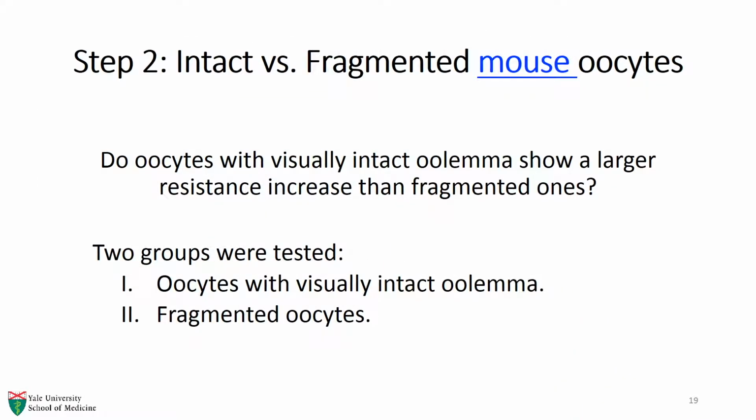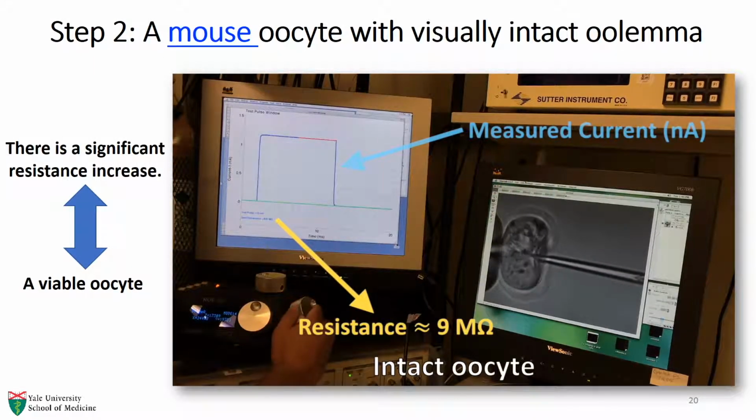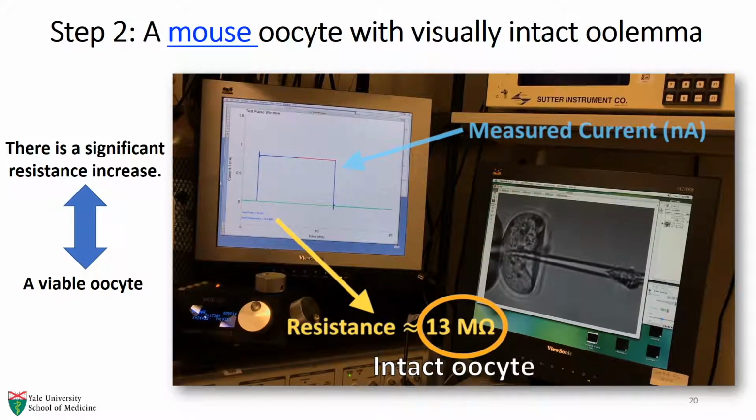The next step was to measure resistance change in oocytes with visually intact oolemma versus fragmented ones. In this video, we see an oocyte with visually intact oolemma. The large resistance increase confirms its viability. The retraction of the pipette drops the resistance back to its baseline.